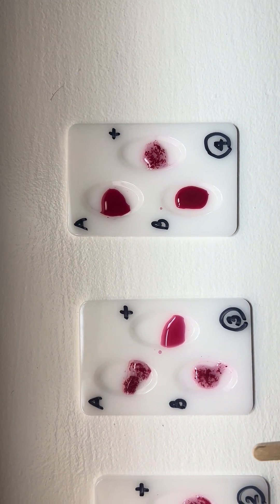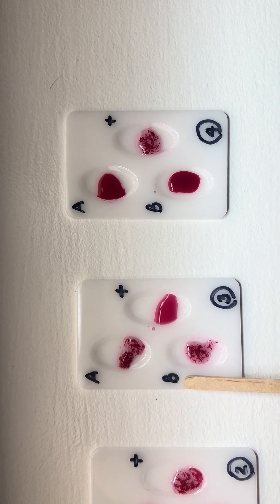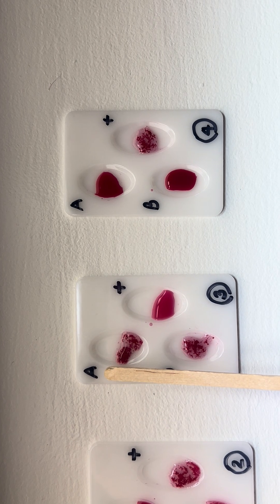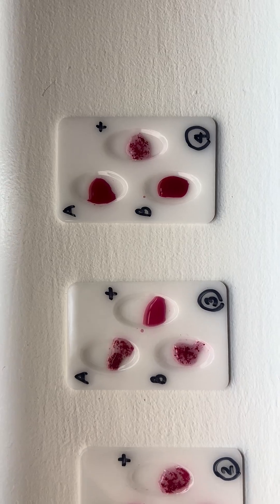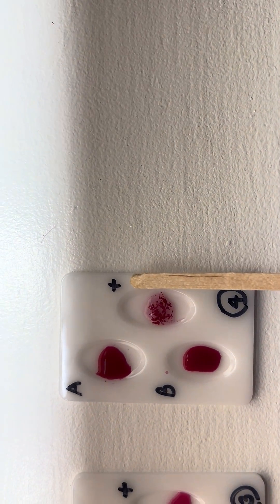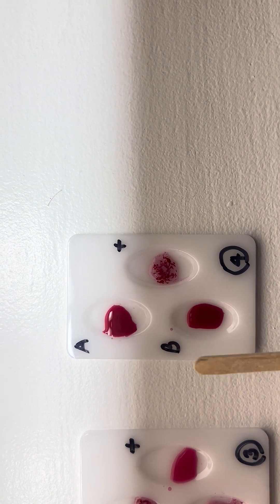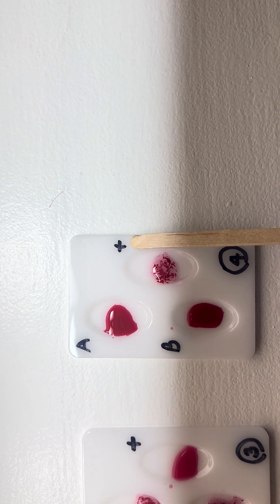In the third tray, we see agglutination in the A and the B wells, but we don't see anything in the positive well — therefore this patient is AB negative. And finally, in the fourth tray, we don't see agglutination in A or B, therefore this patient is O positive.